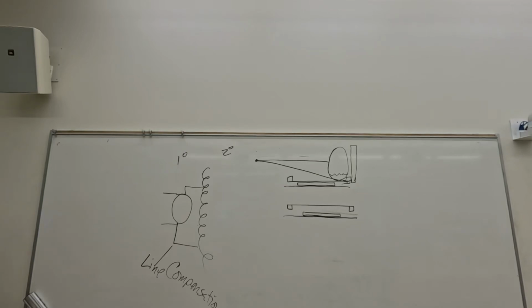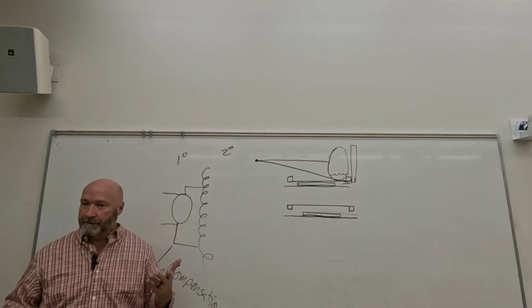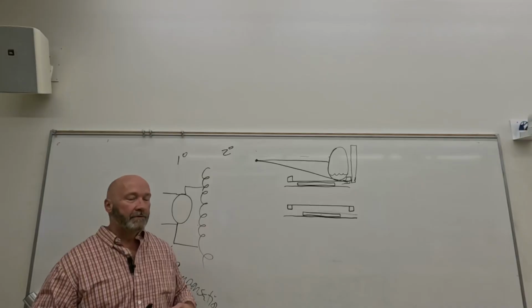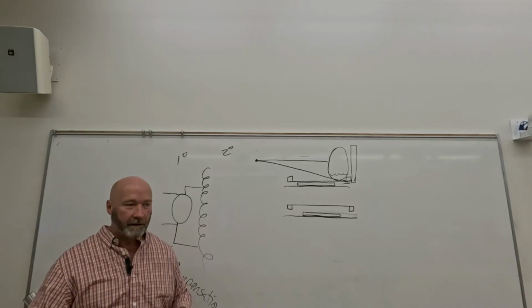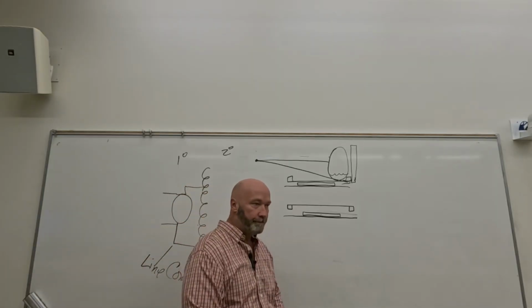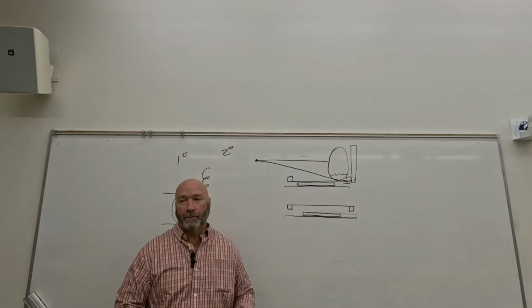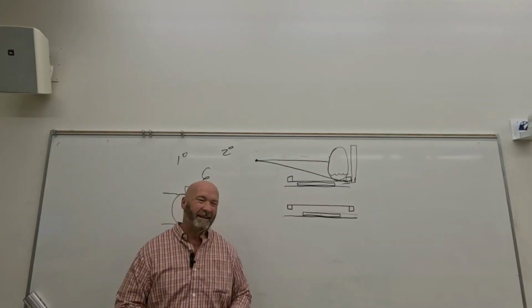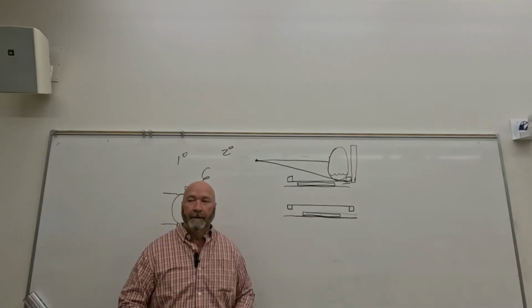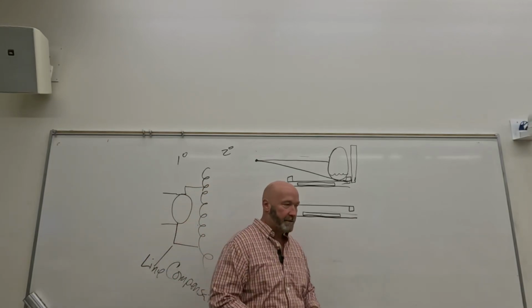One other characteristic of the fluoro room is that the tables do tilt, right? So they'll tilt in both directions in most cases. And they'll go all the way up to 90 degrees in one direction so that you can stand the patient on the footboard so that you can do things like upper GIs and barium swallows, starting the patient upright. You generally don't do that with a myelogram, but with upper GIs and esophagograms, you usually start with the patient standing up.